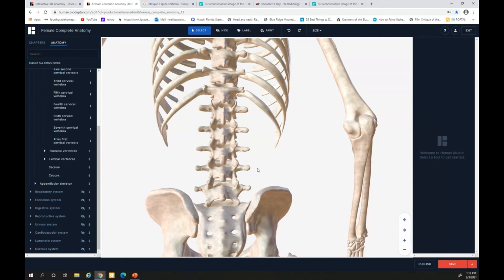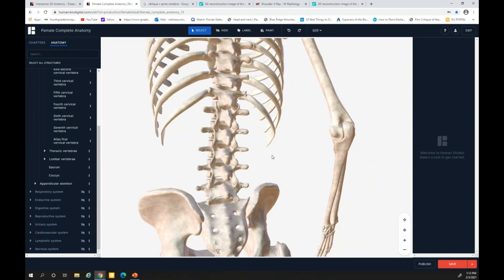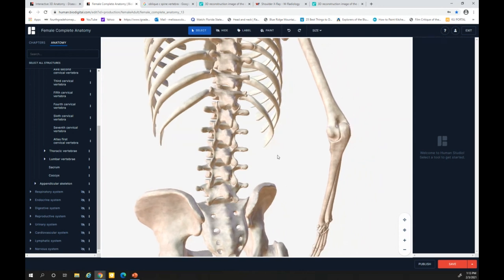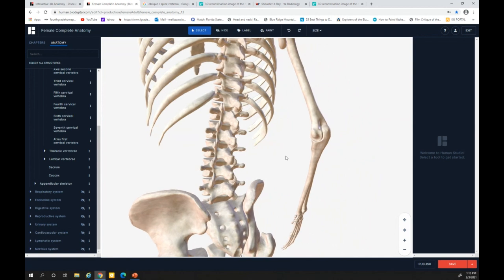All right, so I'm going to rotate them into an RAO, so his right arm goes toward the bucky. If I can rotate it nice and straight for you. And there he is. You see that dog coming into view. Nice open zygapophyseal joint. Now look at that ilium elongated.